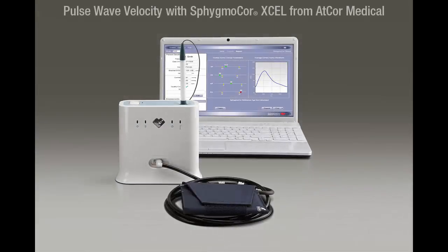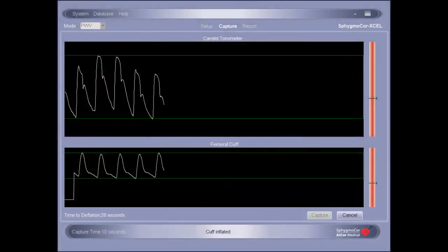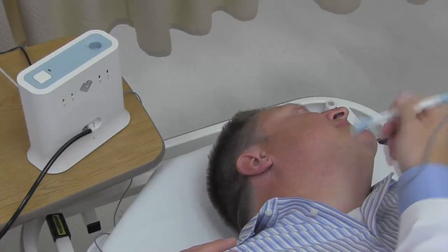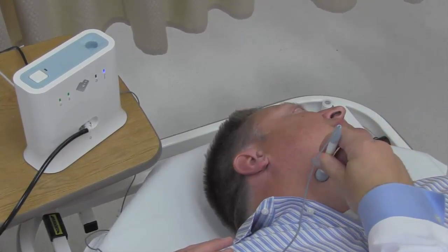Welcome to the SphygmoCore Pulse Wave Velocity tutorial. This video will familiarize you with the operation of the SphygmoCore system and how to properly conduct a pulse wave velocity assessment. This tutorial does not cover system setup. If assistance with system setup is needed, please consult your operator's manual.